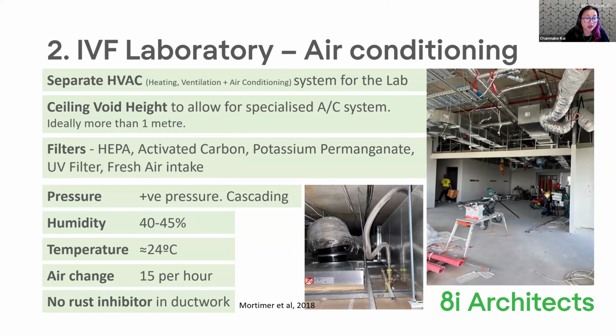They want it cold. And a lot of times for OPUs, for egg pickups, the scientists don't want it that cold. They actually want the operating theatre warmer. So there's always a bit of contention between hospital staff and scientists in terms of temperature. But in the lab, ideally, you want it a little bit warmer than what you would normally have.